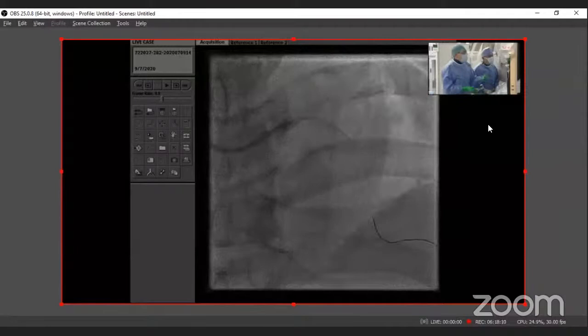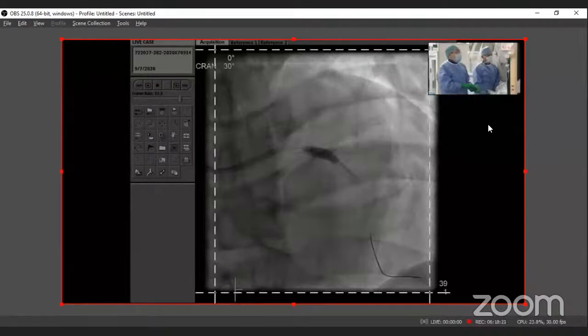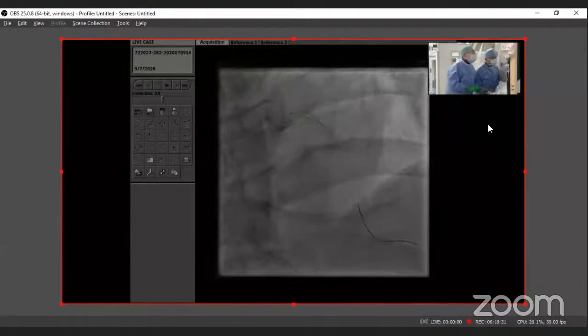So I think for PCI, for the wire that we use, just use a few wires that you are familiar with, so that you know the properties of the wire. So for side branch crossing, like in bifurcation, if you have difficulties crossing, maybe a hydrophilic wire may be easier to cross. Yeah. 14.